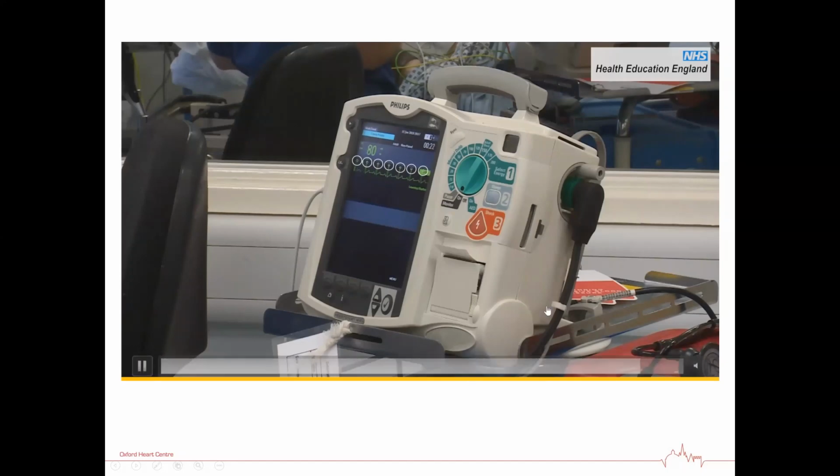Seems like the video has crashed, and that's probably why the sound quality has gone. It started again, and those little white dots, they just come up circles to highlight. And that's what synchronization looks like.